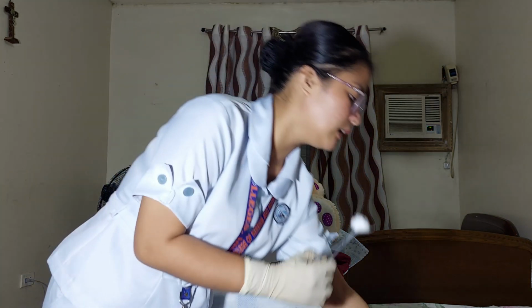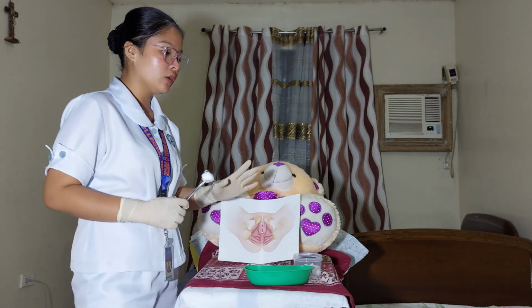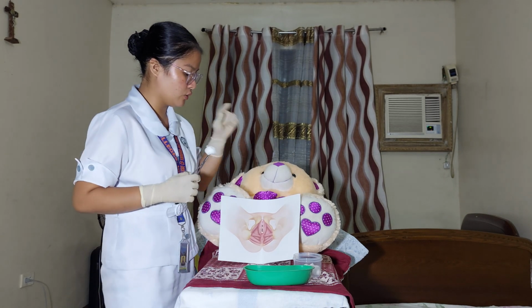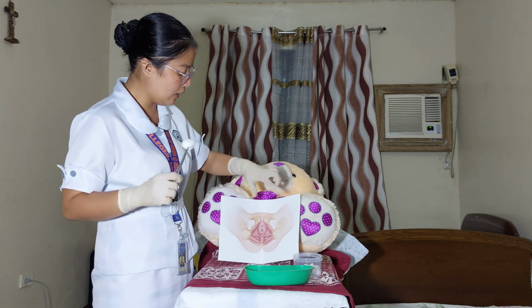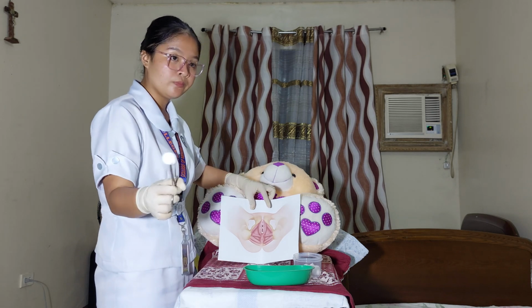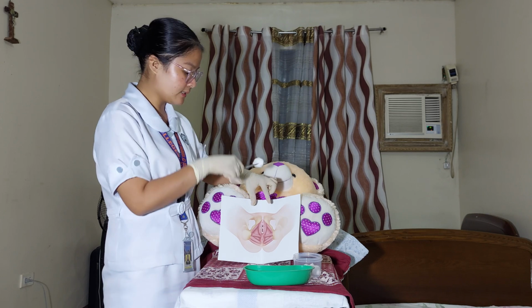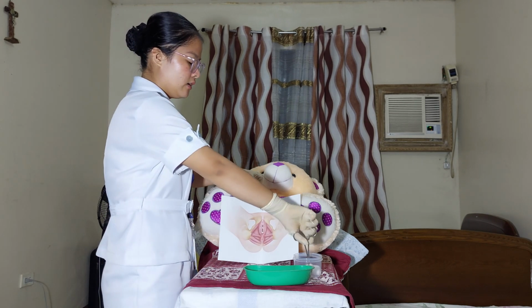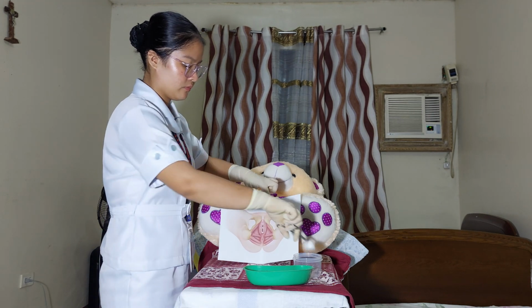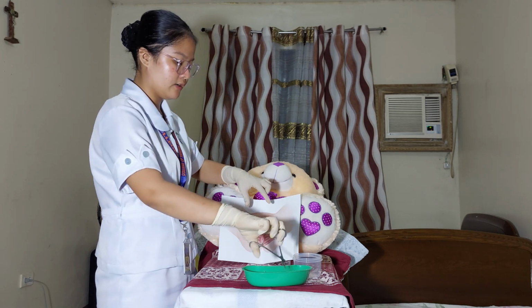So, mag-ready din kayo ng kidney basin or na kahit ano na pwedeng i-dispose yung ating mga cotton balls. So, let's say na nakahawak na siya sa meatus ng aking patient is now I'm going to ngayon is ipupunas ko na siya isa, then discard, isa, discard, isa, discard, and isa, discard.